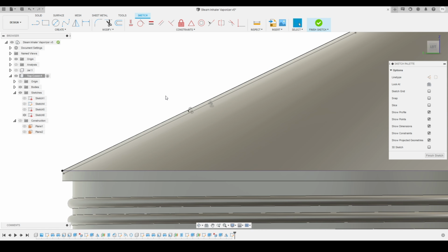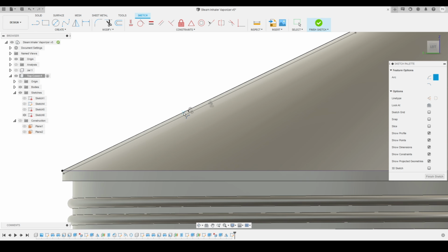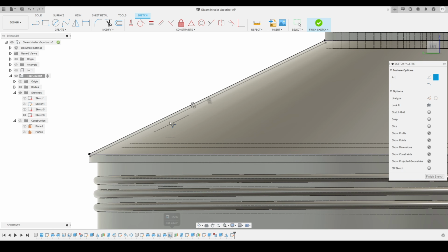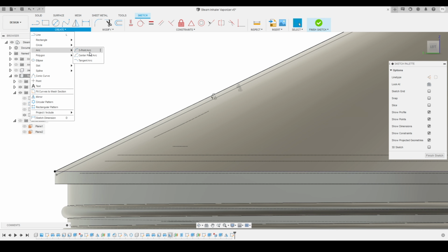So here you can see I just offset this line by 0.3 millimeters, and then we'll go to the create panel and activate the 3-point arc tool, and I'm going to create an arc on this particular line. Before that I will change this to shaded with visible edges. So this is the view I am getting. So I am going to create an arc. Before that, I will activate the 3-point arc tool.